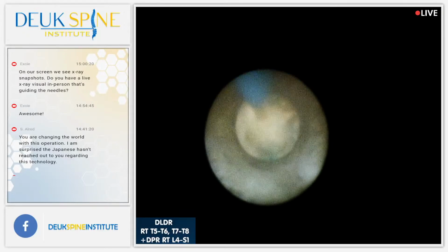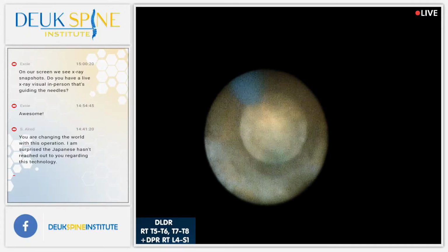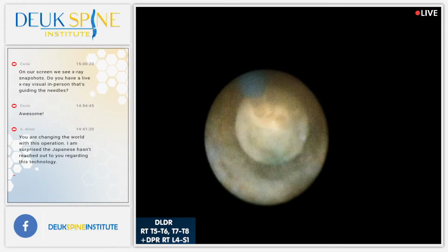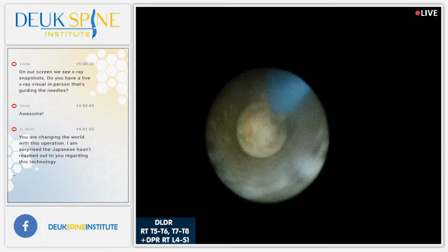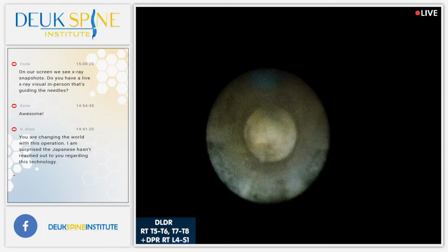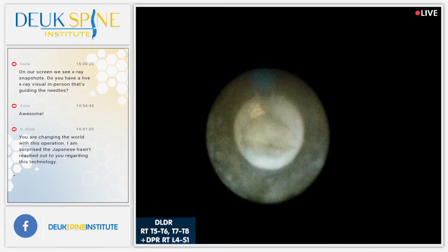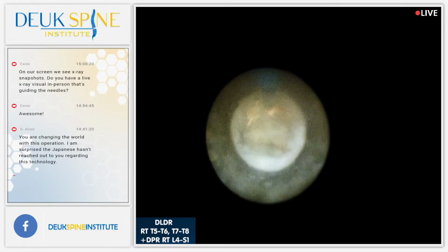You can see the gold color. It's kind of like an orangey gold when I hit it with the laser. That's calcium. Why would you have little calcium in there? Okay, if you look at that on an x-ray, you won't see it. But over time, it gets more and more and more of it, and you can see what's called a disc osteophyte, because so much calcium gets built up that it looks like an osteophyte or a bone spur. And like I said, most of the time, the bone spurs aren't the problem. It's this inflammation happening in this tear that is the problem. So you can see I'm cleaning that tear with the laser, and it's going very well.